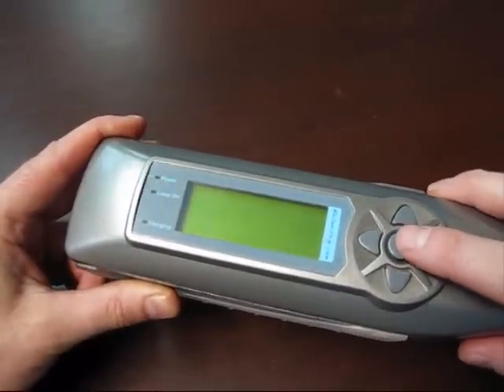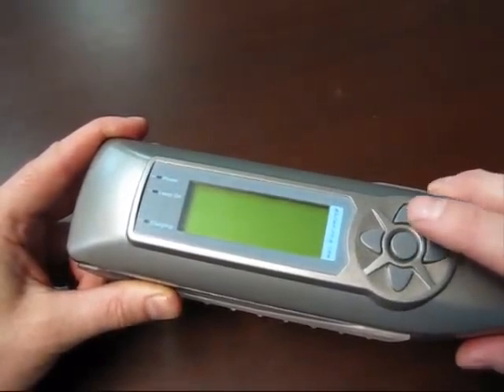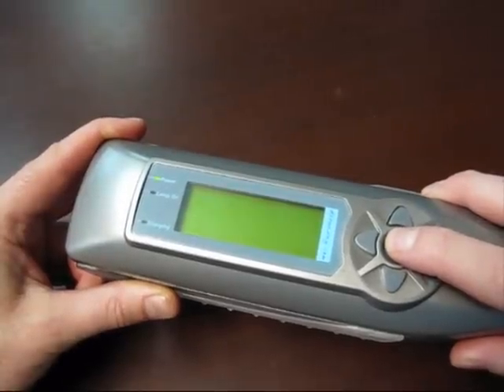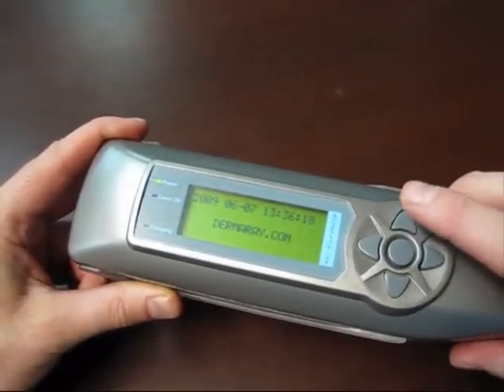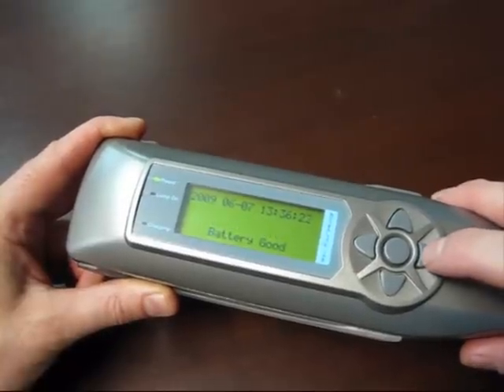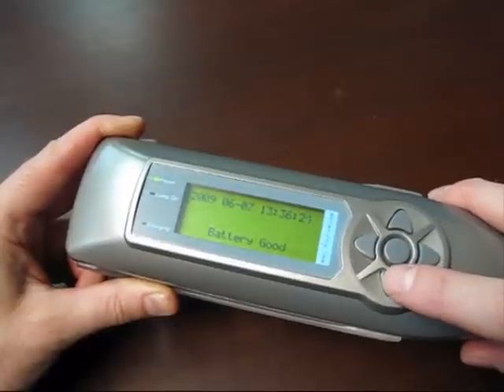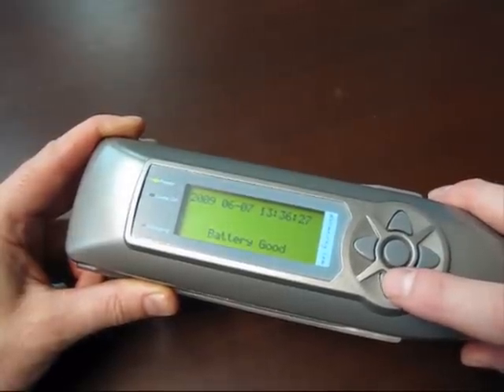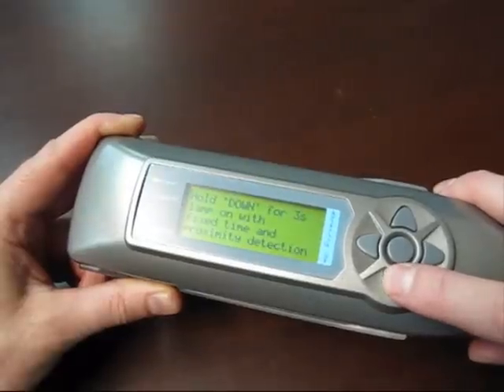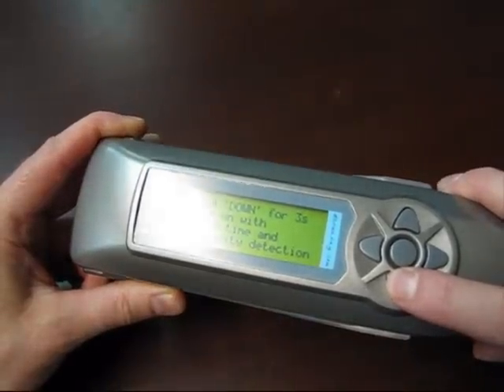Just to demonstrate the other manual method of turning the lamp on, hold down enter again for 3 seconds. We've gone through on until it's turned off, loading the last patient's next treatment. Now I'll just display how to turn on the lamp for a predetermined amount of time. Hold down the bottom key or the down arrow for 3 seconds.